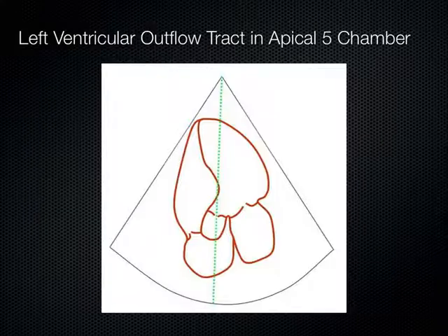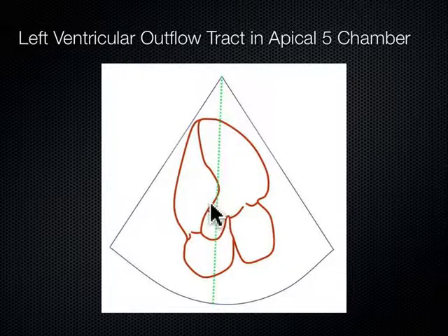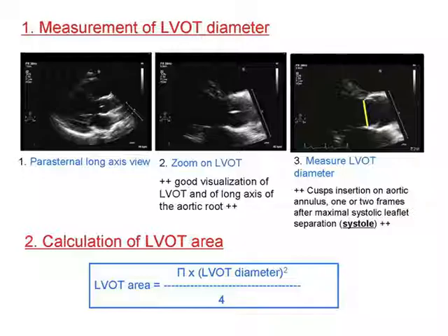Now, that left ventricular outflow tract seen in that apical 5-chamber view, this is just a schematic of it. This is where you're going to be dropping that Doppler gate right through here. And somewhere along that gate, you'll see that little TIE fighter looking thing. That's going to be just somewhere right on the edge of this aortic valve, just right along here. That's where we're going to be dropping that Doppler little TIE fighter, in this general vicinity. And that will set us up to measure the cardiac output. Let me show what I mean.